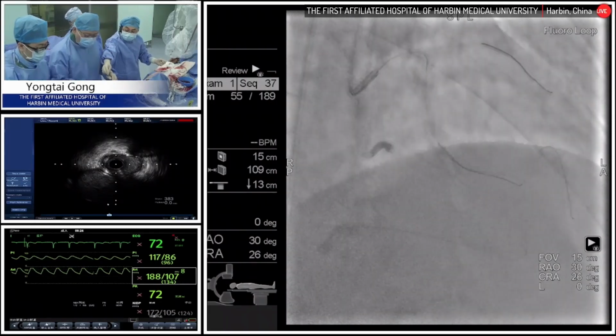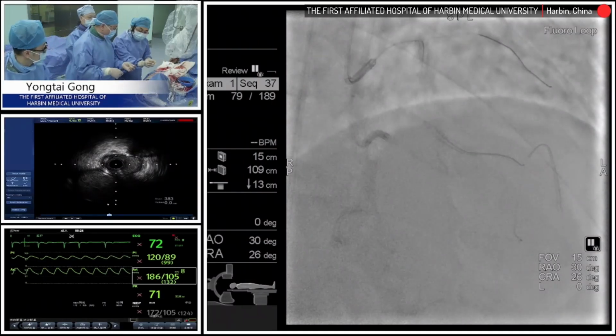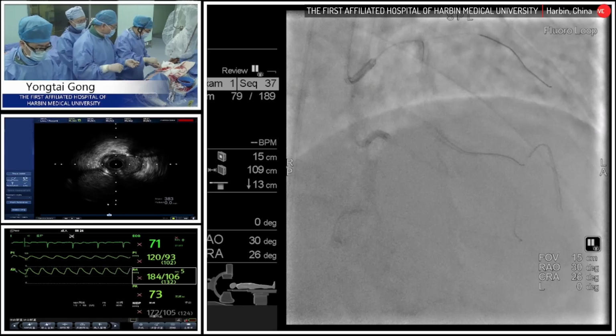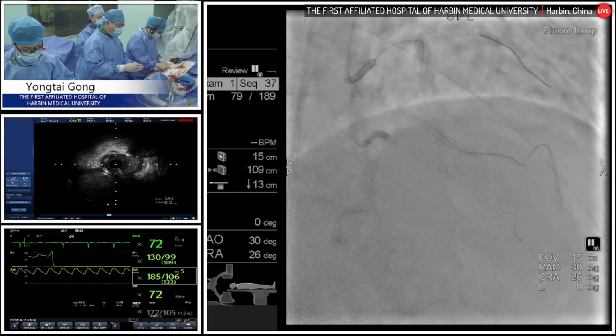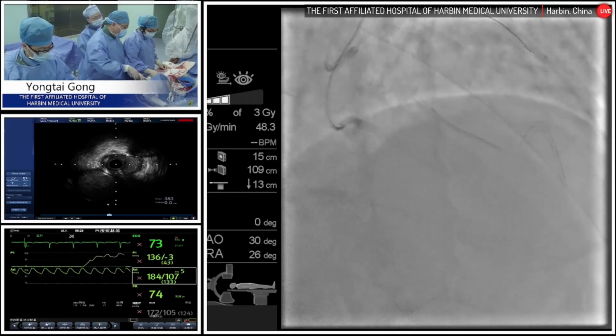to the septal branch. And we can see that currently the wire is in a relatively distal connection of the distal RCA branches' collateral flows. Actually, we made some supraselective angiography with the microcatheter and also floated the wire several times to trace each of the connections to the septal collaterals.